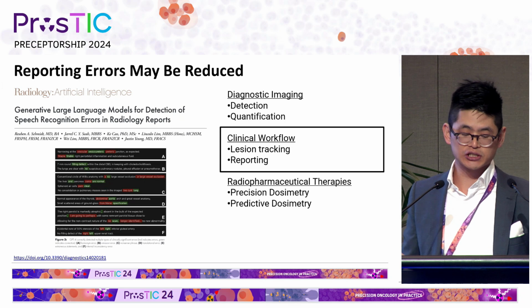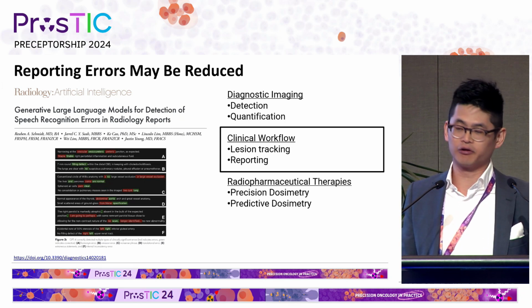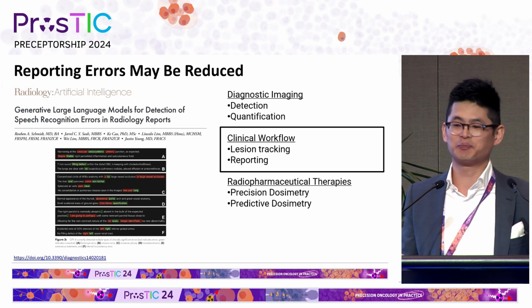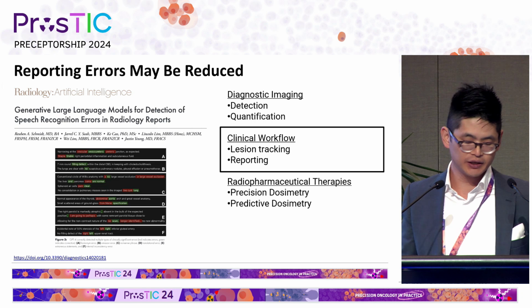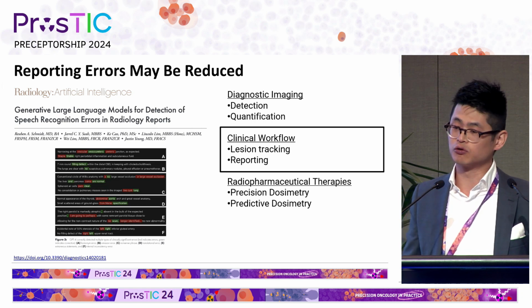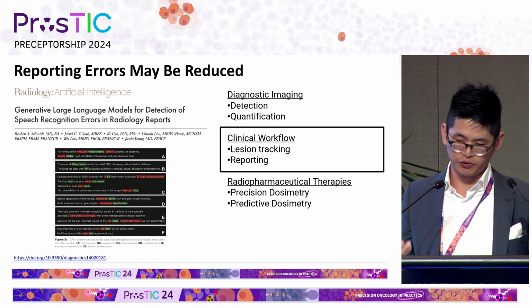Use of AI is not just limited to images, but can also be applied to text. And we know that reporting errors are a bugbear that can slow down care and require clarification. And spell check has its limits. In this study, text-based models like GPT-4 demonstrated high accuracy in detecting clinically significant errors in radiology reports with F1 scores over 87%. And this can be clinically useful for reducing those errors.